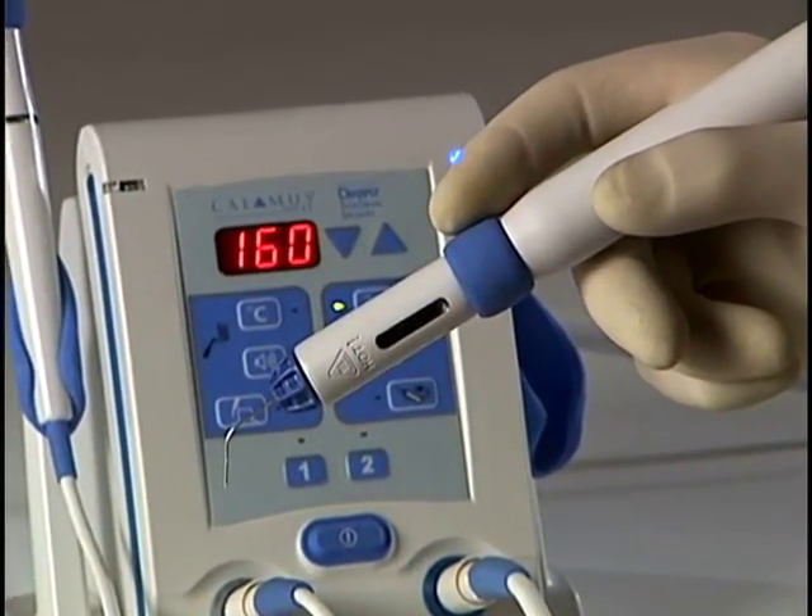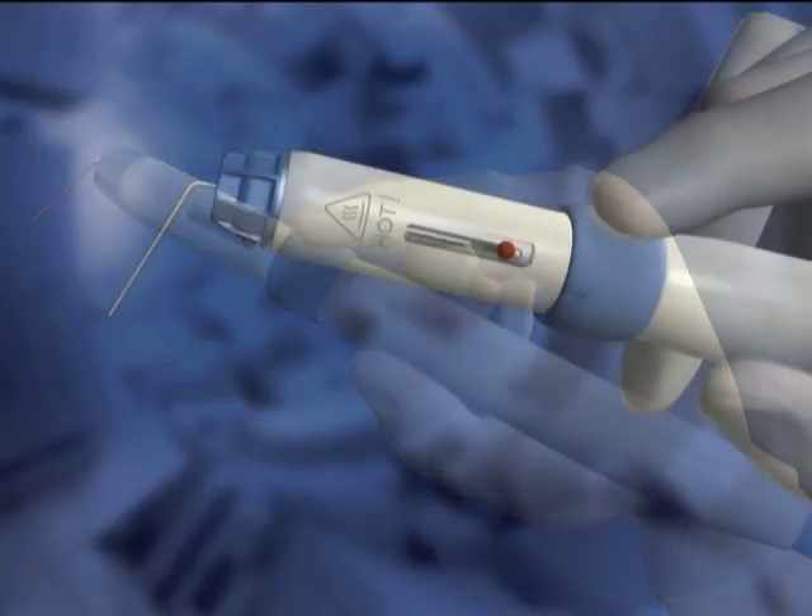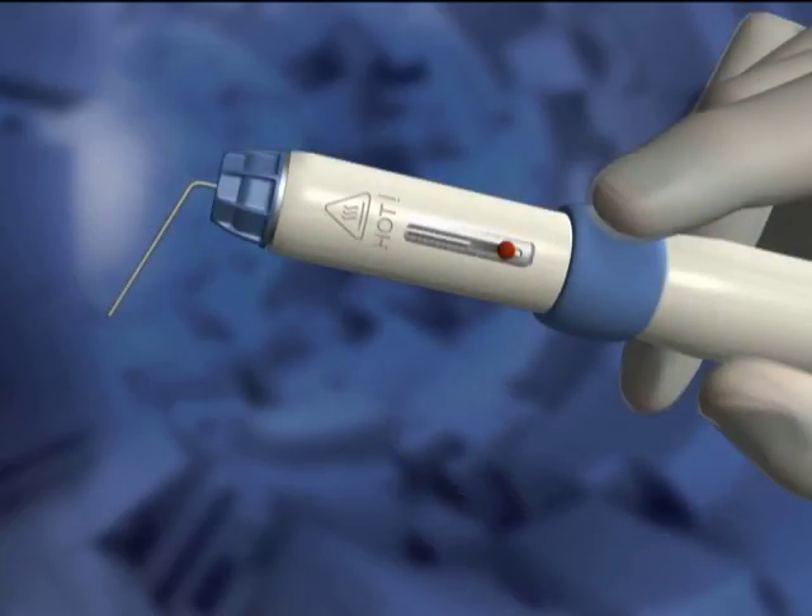Handpiece operation is as easy as holding a pen. A simple two-finger grip, where the handpiece is resting in the V between the thumb and forefinger, is where you may feel most comfortable holding the Calamus Flow. This style offers good balance and allows for easy pressure on the activation cuff.